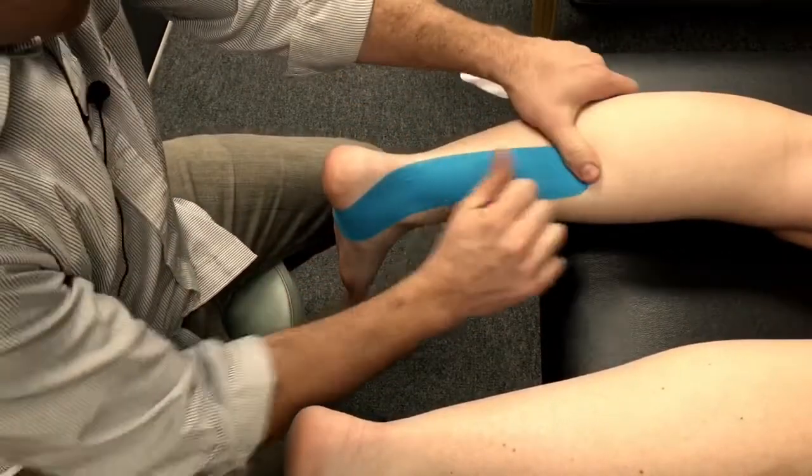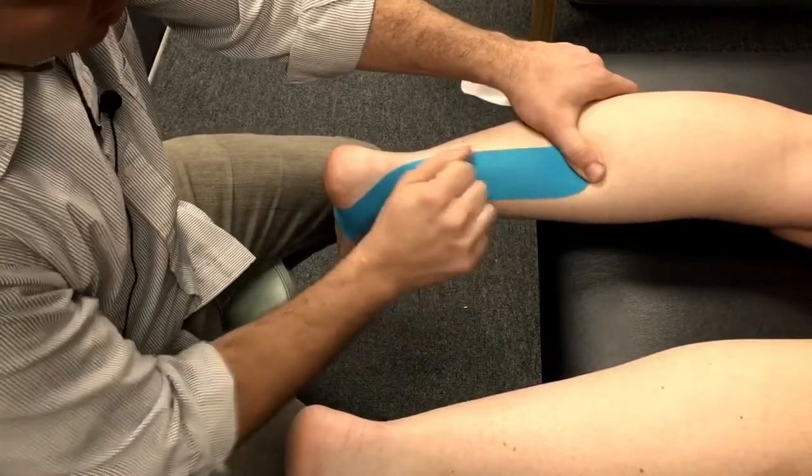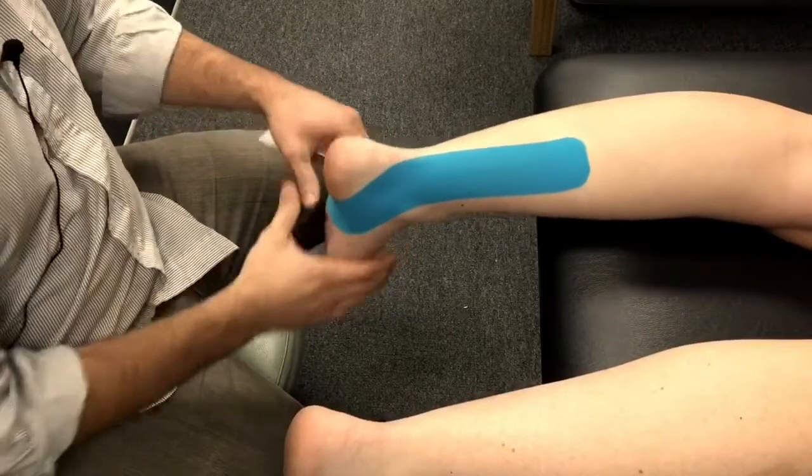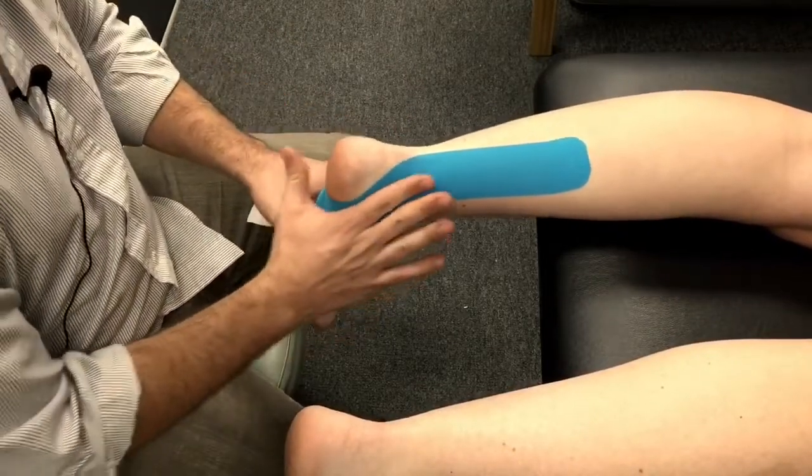Then we just rub it down and kind of warm up the adhesive a little bit to help it stick a little better. So there it is — a taping for posterior tib.